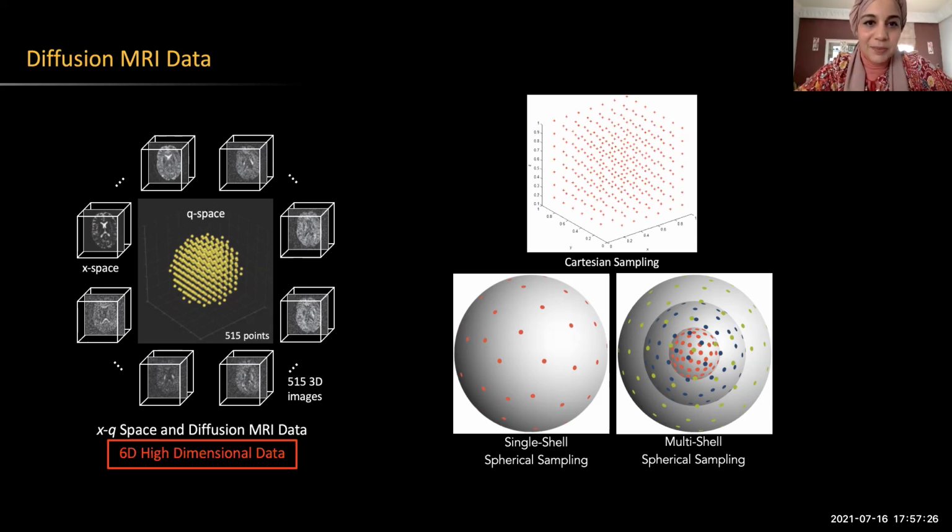Yeah, this is how you explained it earlier when you computed the affinity matrix. You take into account the location, which is the image in the 4D space, because you have different gradients, and then you have the gradients themselves, right? And then you have the B value. That's the formula you use to compute the affinity matrix of your input graph, right? Yes.